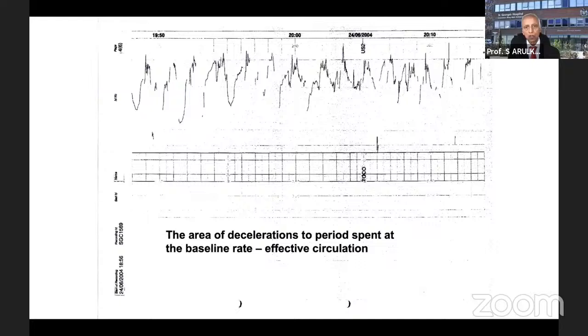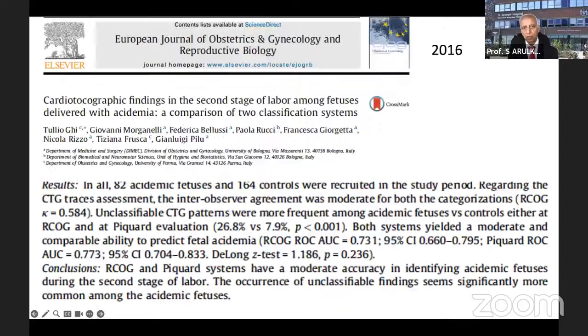Even at this stage, no action was taken because they thought the baby is going to be delivered. But as you could see, this is like a subacute hypoxic pattern with deceleration lasting for a longer time than the time at the baseline. And the outcome was poor.